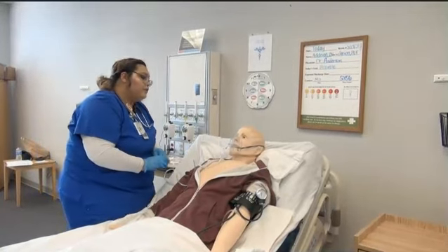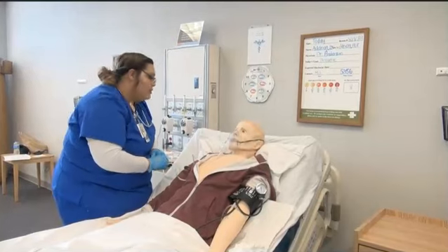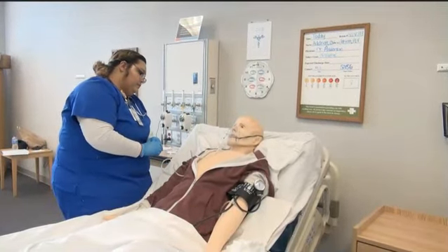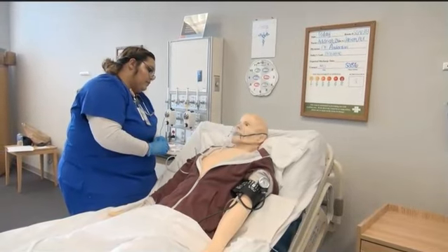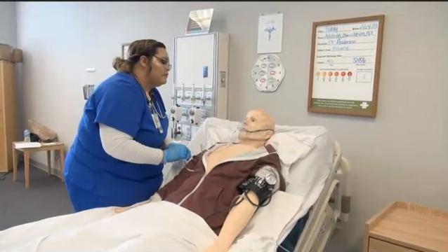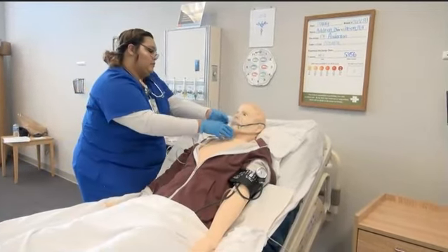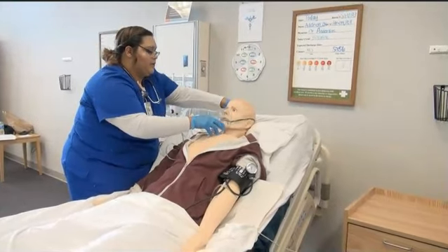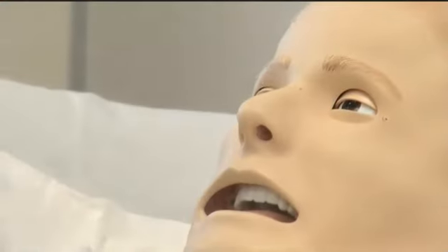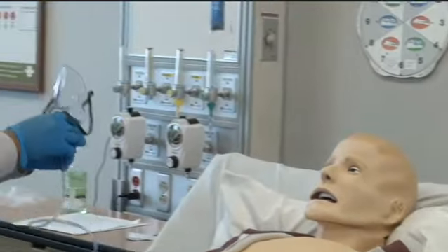So I hear a little bit of sputtering in the medication. That means your treatment is almost done. Sputtering is noted, which indicates therapy completion. Notice, I'm going to take this off. She removes the therapy from the patient prior to turning off the oxygen.